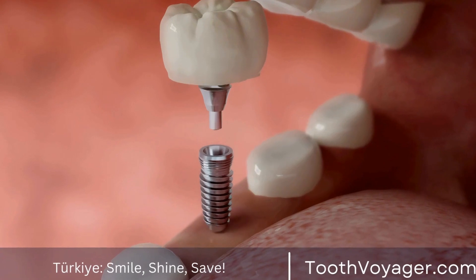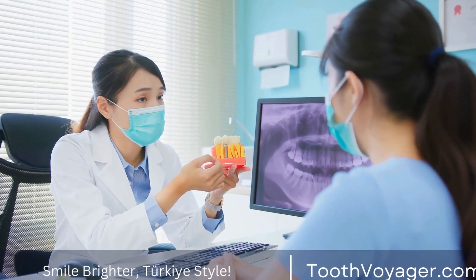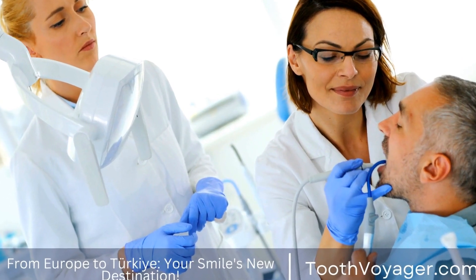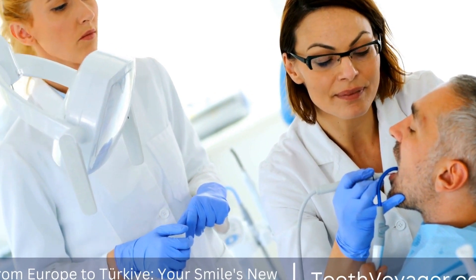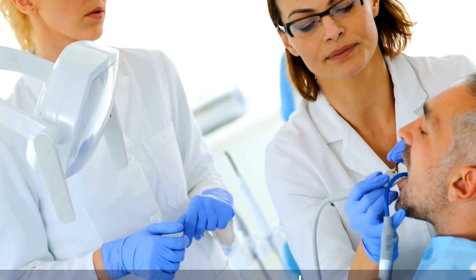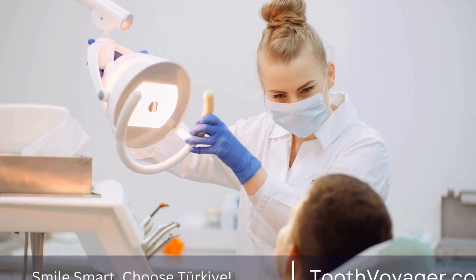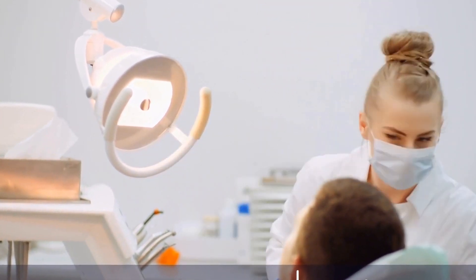Intraoral Scanners. Intraoral scanners have made the process of taking impressions of the teeth much more comfortable and efficient. Instead of using messy impression materials, dentists can now use a handheld wand to scan the patient's teeth and create highly accurate 3D models. These models can be used to design crowns, bridges, and other restorations with precision, leading to better fitting and more durable outcomes.